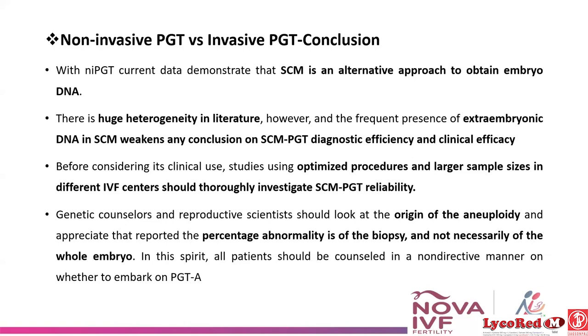So whenever counselors are counseling the patient, they should inform the patient that when we are doing the embryo biopsy, we are not considering the whole embryo. We are taking a few cells. So it may represent the embryo, or it may not represent the embryo. So it should be very well known to the patient.